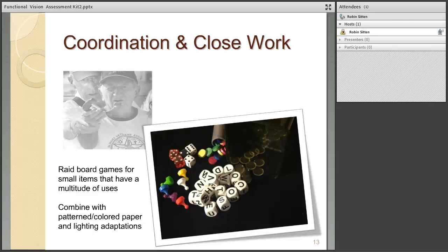And again, it can be encouraging for some people to find strategies for the simple things that give them pleasure, like playing games with children or being able to participate in group activities.